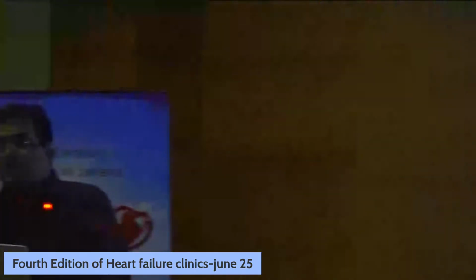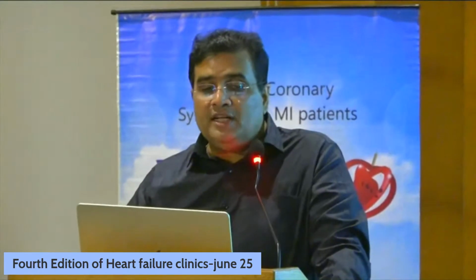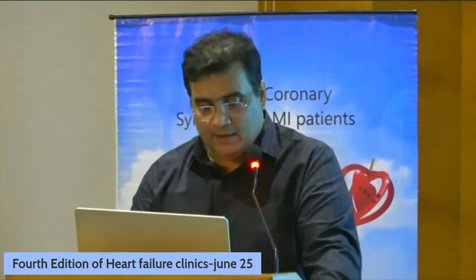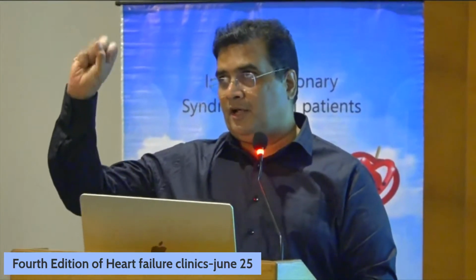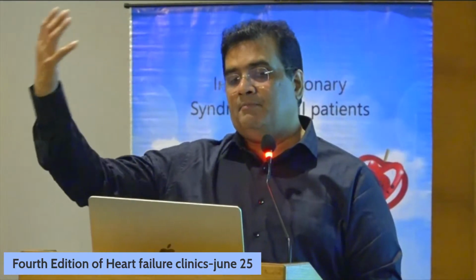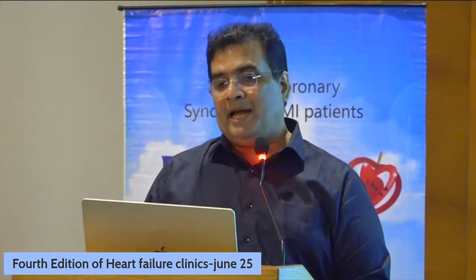Apart from ventricular function, we can estimate the myocardial perfusion also. That is what we call the MCE or myocardial contrast echo, with the same contrast. When you look at the ventricular function, that is not a cellular thing. It is at a macro level. But if the myocardial contrast echo is reduced, that means the cellular dysfunction is there. So with this contrast echo, we can determine whether there is a cellular problem or a macro problem in the heart.